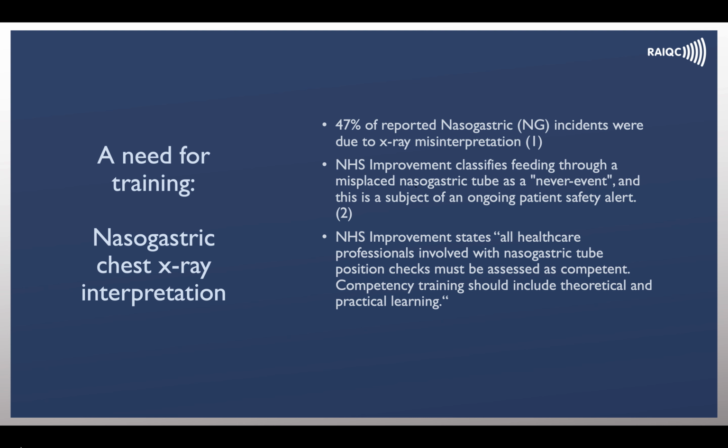Today, I'd like to focus on the nasogastric module available on the RAIQC platform. But first, a bit of background. In a recent NHS Improvement study, it was identified that 47% of NG-related incidents were due to X-ray misinterpretations, leading to never events. And there was subsequent advice from NHS Improvement that all healthcare professionals involved with nasogastric tube position checks must be competently trained, including theoretical and practical learning.